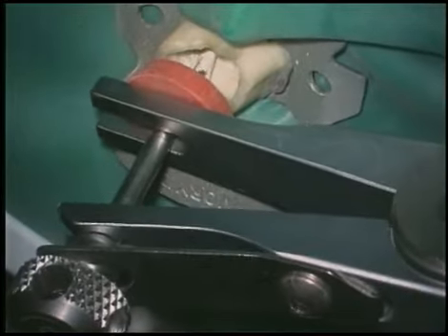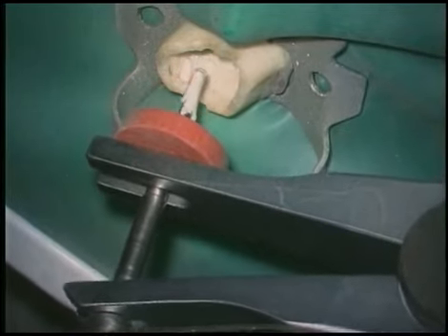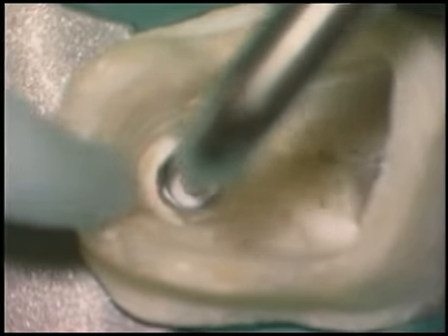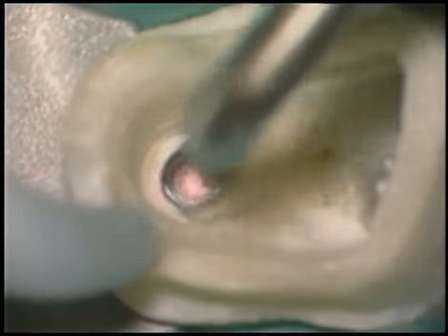Now with the post out, again we're going to encounter cement apical to the post. We can select an ultrasonic parallel-walled instrument used at low intensity to brush cut away and blow out this material. Progress until you see pink gutta percha, and now you can proceed with the appropriate retreatment technique.